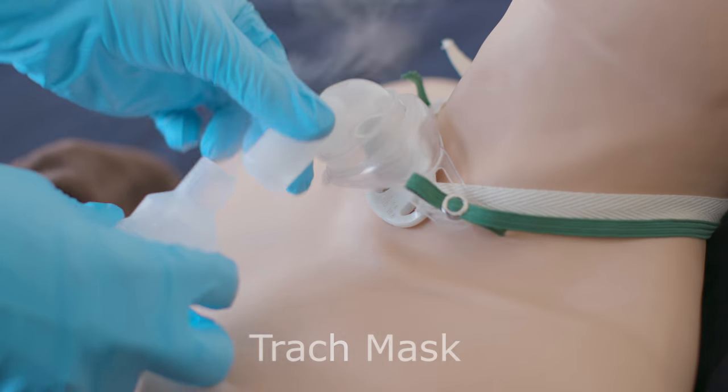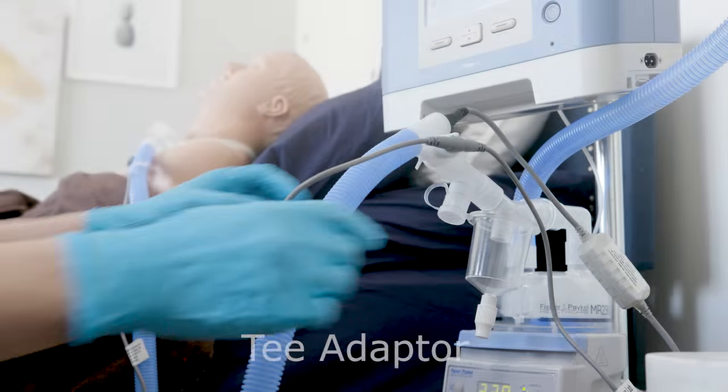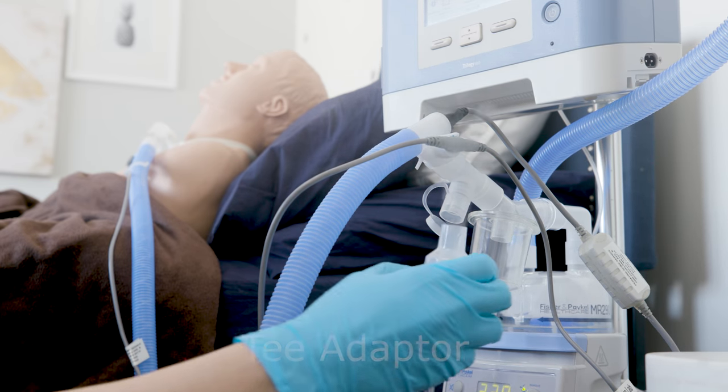If the patient has a trach, place a trach mask over the trach, or connect a T adapter to the ventilator tubing circuit to deliver the treatment.